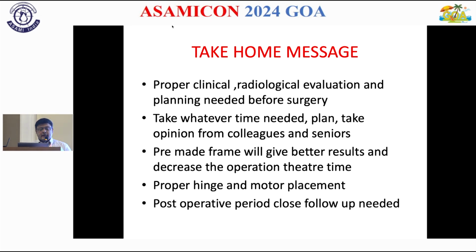Pre-made frame will give better results and decrease the operation theatre time in deformities. No decisions on the table. You should just do the case within 1 hour on table. No more thinking on the table. Everything we have to plan pre-operatively. Proper hinge and motor placement is needed. Post-operative period, close follow-up needed.